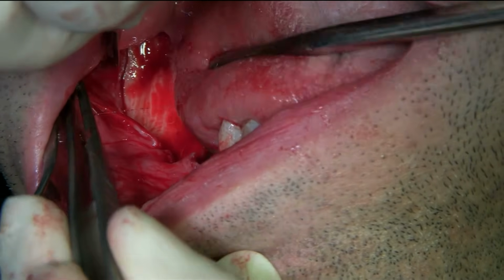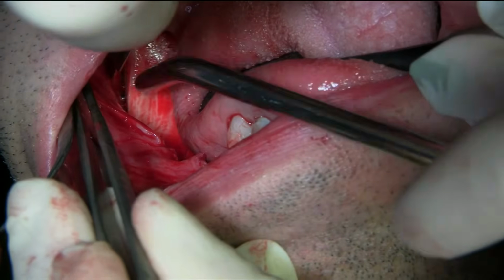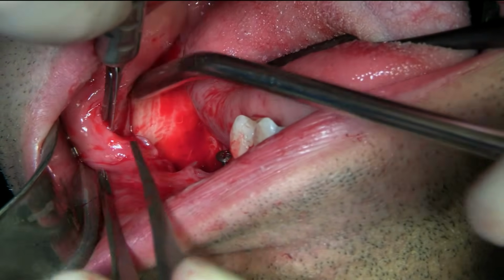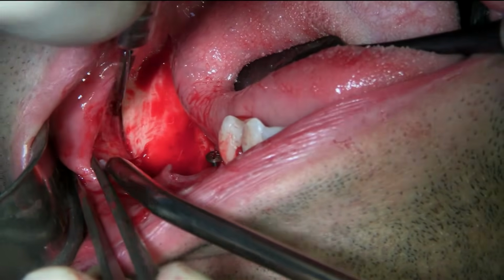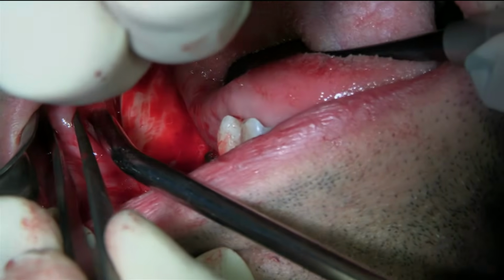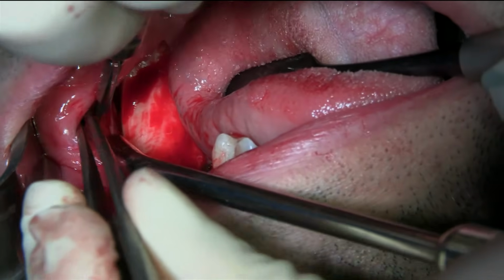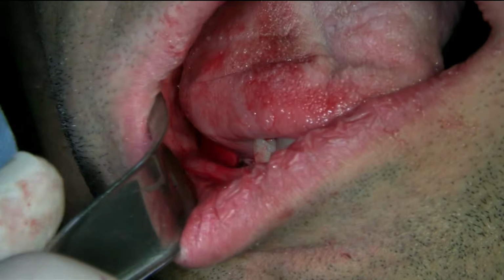Okay. Section. Anterior. We might be done.